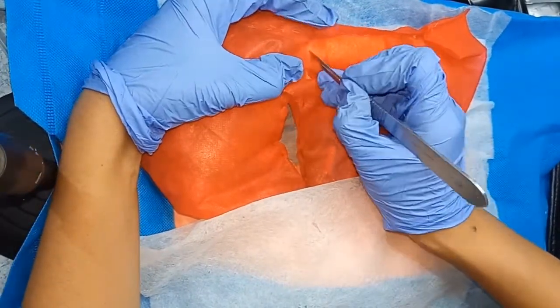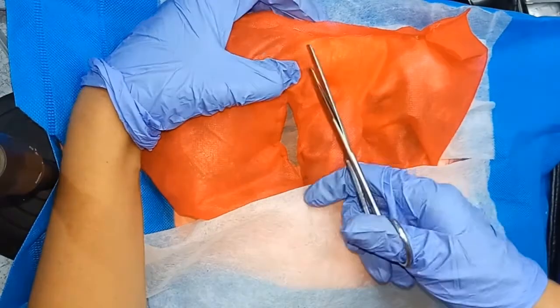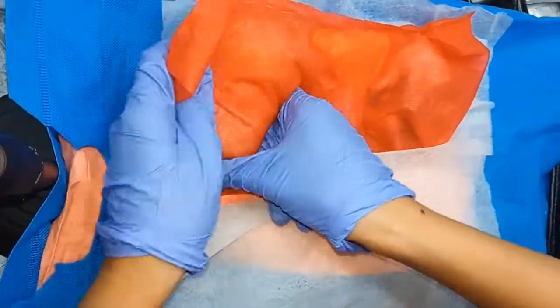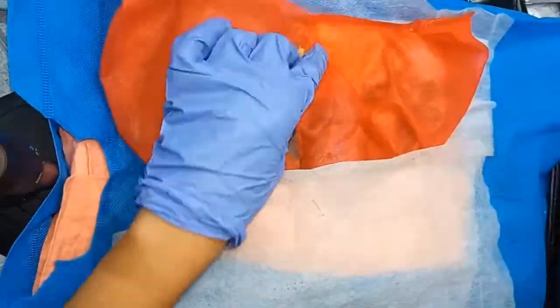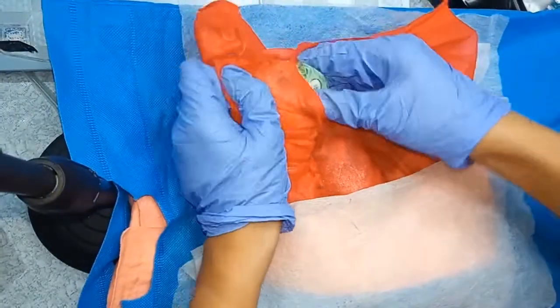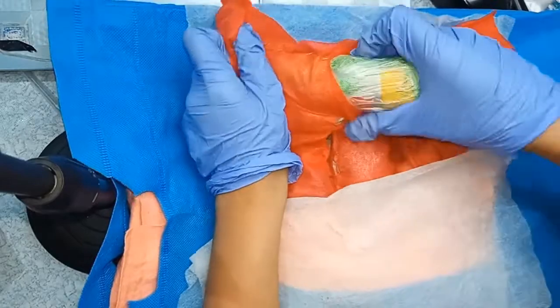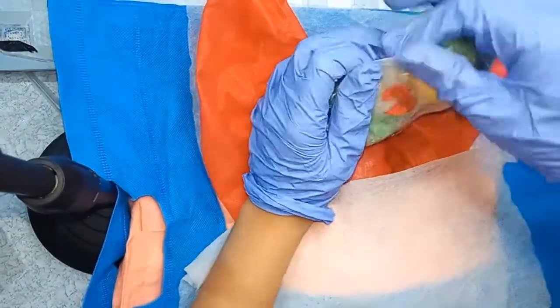Tent the tissue of the uterine wall to avoid inadvertently lacerating a fetus with the scalpel. The uterine incision is then extended with Metzenbaum scissors to a length sufficient for easy removal of the fetus. Move a fetus to the incision by gently squeezing the uterine horn. Once the fetus is near the incision, it may be grasped and gentle traction may be applied to facilitate rapid removal from the uterus.